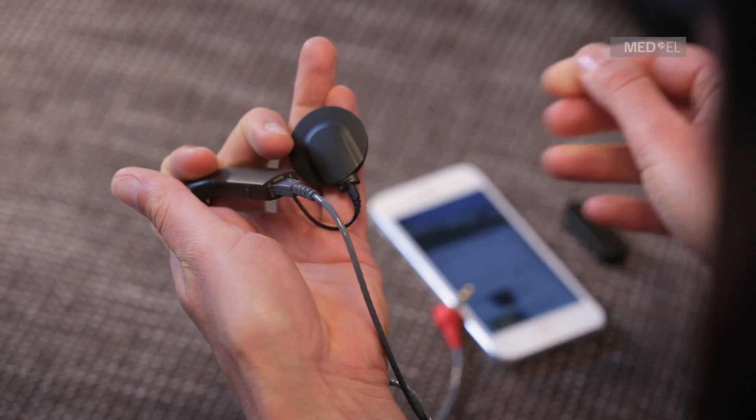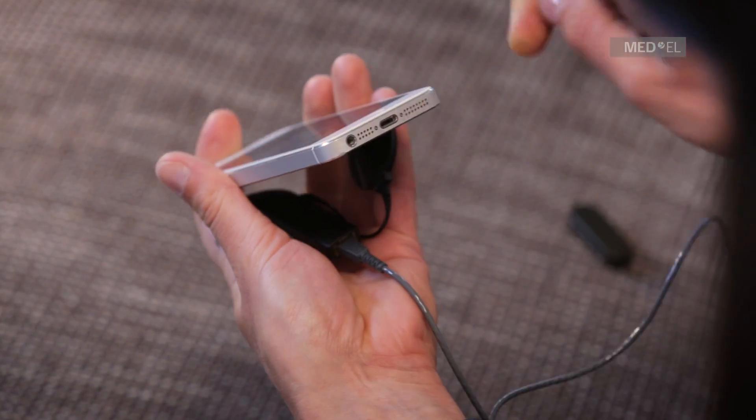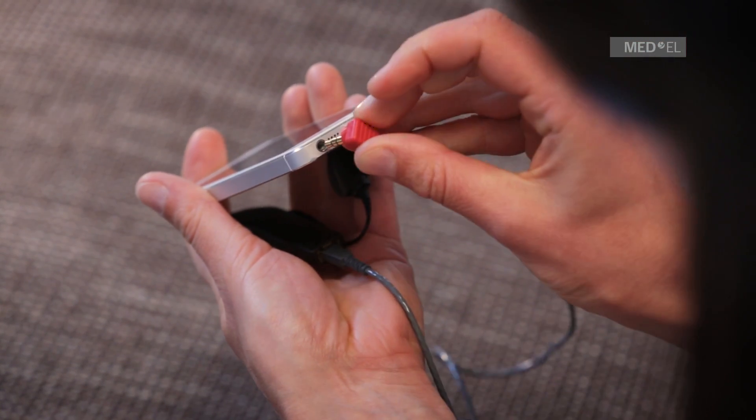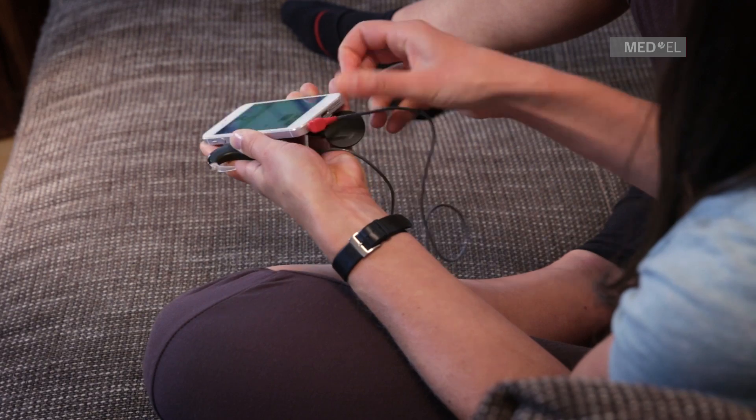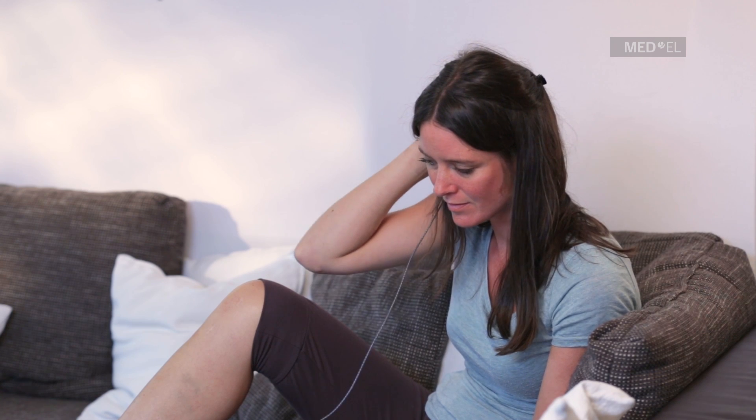Sonnet will automatically detect sound signals. The EXT cable has a red plug and provides signal only from the external audio source. The MIX cable has a yellow plug and will provide a mix between the external audio source and the microphones.